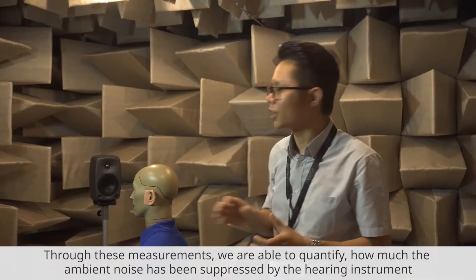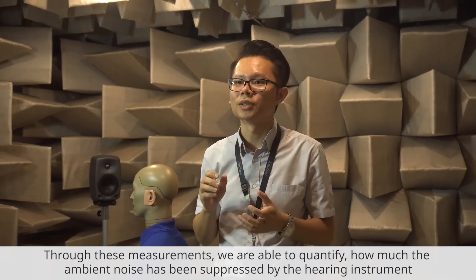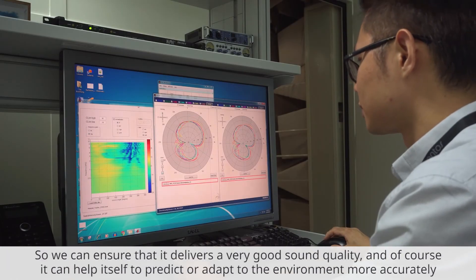So through this measurement, we are able to quantify how much the ambient noise is being suppressed by the hearing instrument while retaining the desired sound source from certain directions, so we can ensure that it delivers very good sound quality.